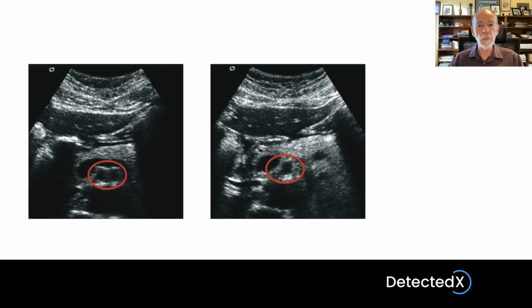So we've just simply moved off the center line, and now we can see there is actually just a single superior mesenteric artery. So this is one situation where this does quite often happen when you're scanning on the abdomen, and the effect is being caused by the rectus abdominis muscles.